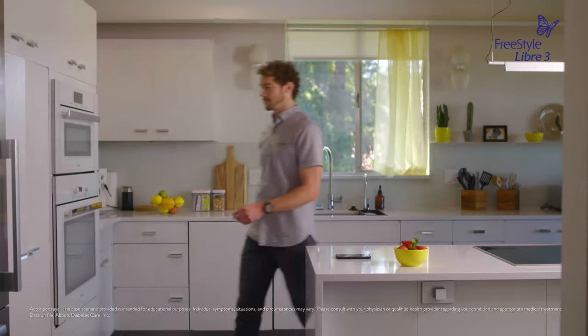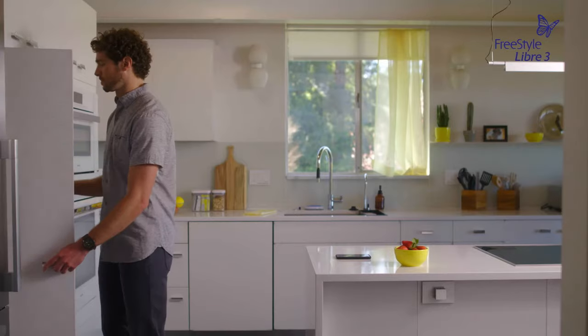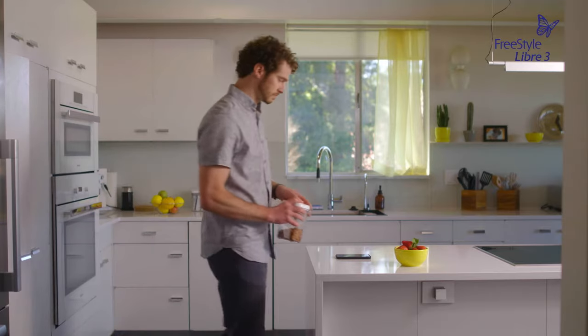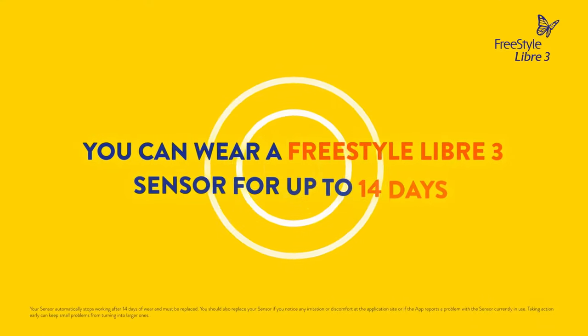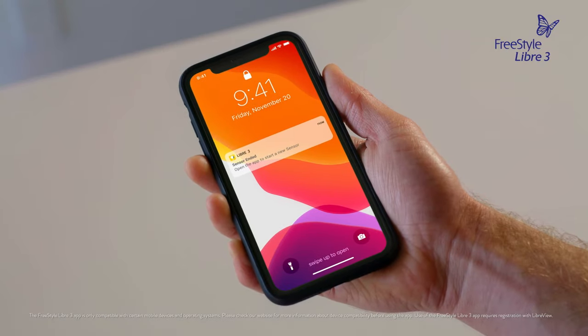The Freestyle Libre 3 sensor is so small and discreet, I hardly notice I'm wearing it. And removing and replacing a sensor is easy. You can wear a sensor for up to 14 days, and the app will tell you when it's time to replace it.